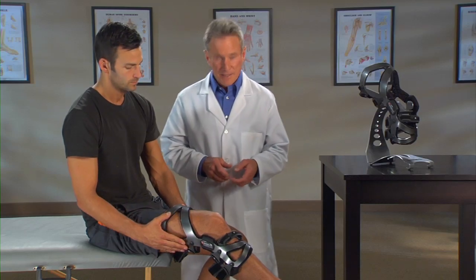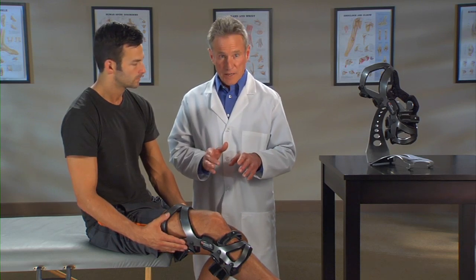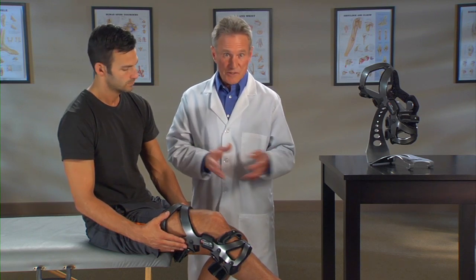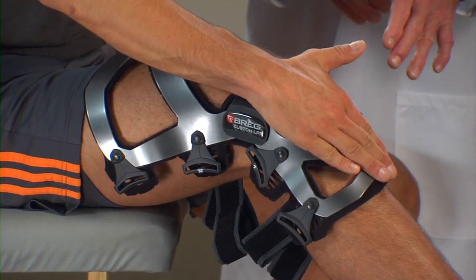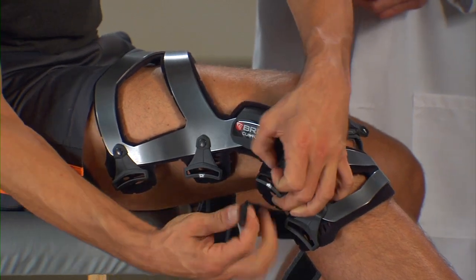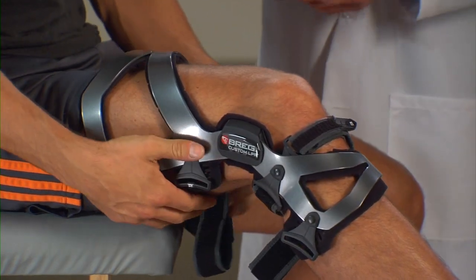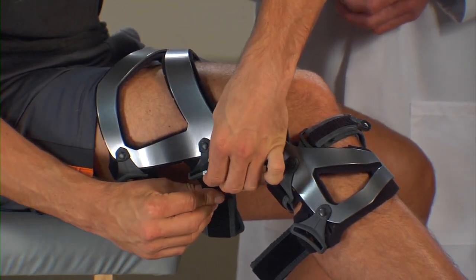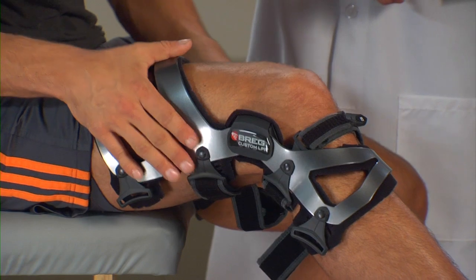Now we'll go through the strapping sequence. As you can see, the straps are numbered, making it easy to follow the correct order. As you go through the strapping process, make sure each strap is tightened snugly but comfortably and with equal tension so that no one strap is tighter than another. With the brace on your leg, press the shin cuff on the front of the brace flat against your leg and fasten strap one behind the calf. If the straps are too long, adjust the straps accordingly. Fasten strap two in the back above your knee. Make sure the thigh cuff on the front of the brace is pressed flat against your leg and fasten strap three at the front of the brace.